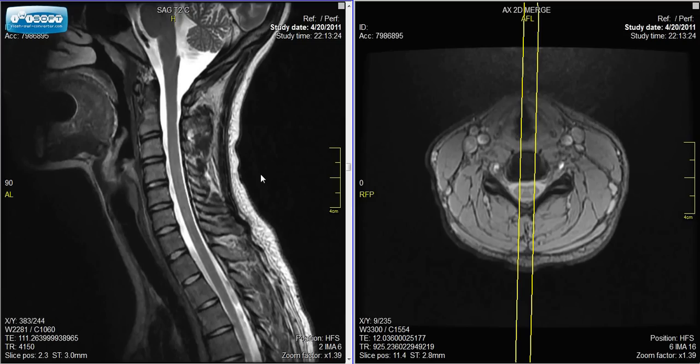Starting on the left side, we're looking at profile views, also called sagittal views. If I scroll side to side here, we're scrolling from one side of the neck to the other. This is a profile of a person's neck — here we can see the back of the head and neck, their throat, and their chin.